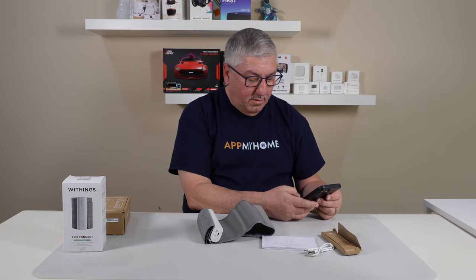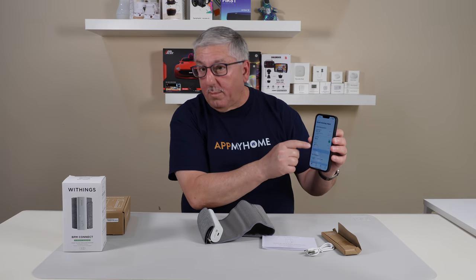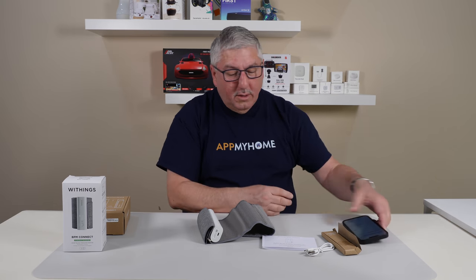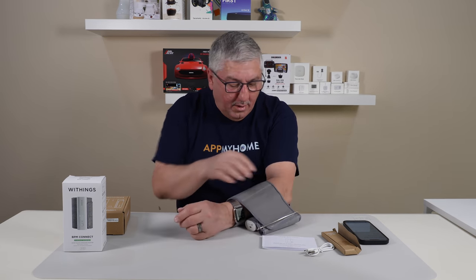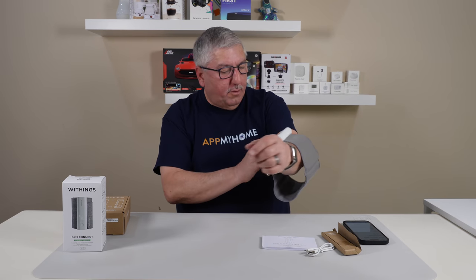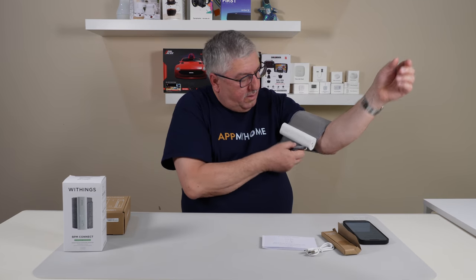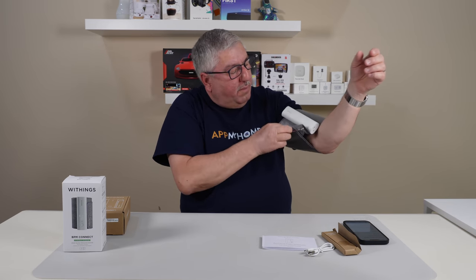The cool thing is I have the app — and you're not allowed to look at my weight, I'm trying to lose some weight. So let's take a look and run this thing on my arm. I'm going to put it on. You're supposed to put this thing here where the button is down below, and then through some miracle you figure out how to make it tight.